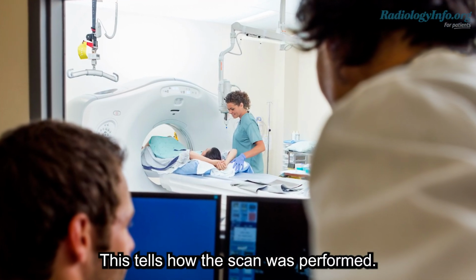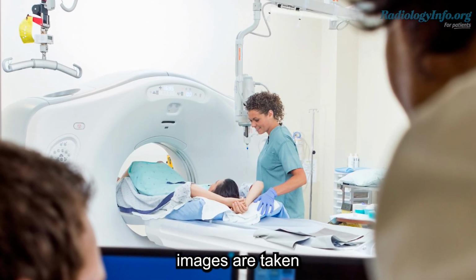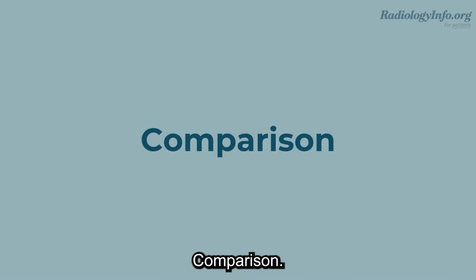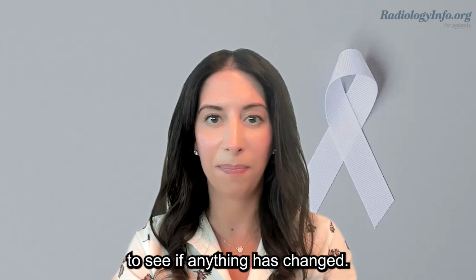Technique. This tells how the scan was performed. For a CT lung screen, you lie on your back, briefly hold your breath, and a series of X-ray images are taken from your lower neck to your upper abdomen. Comparison. Here we check if you've had prior scans and compare them to see if anything has changed.